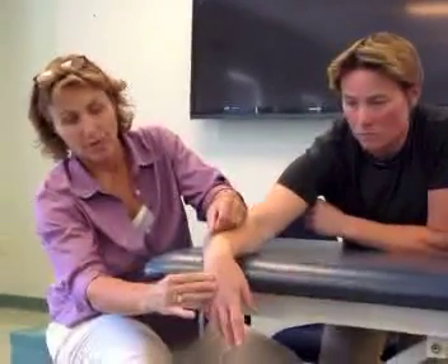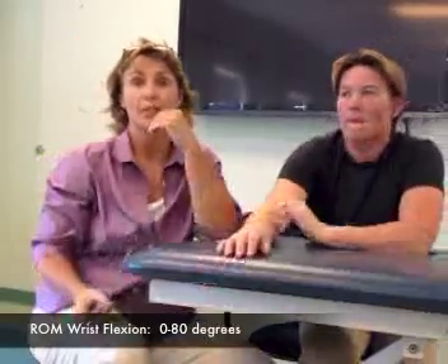So I'm going to bring her down. An 80 is normal for wrist flexion. The wrist should be off the table. The patient's forearm stays on the table — you extend them toward the ceiling, fingers toward the ceiling. And for flexion, it's fingers toward the floor. The norms are 80 for flexion and 70 for extension. The stationary arm, moving arm, and fulcrum at the triquetrum are all the same.